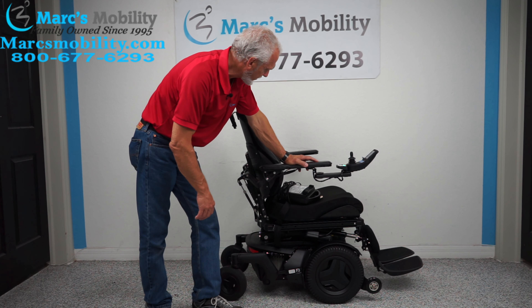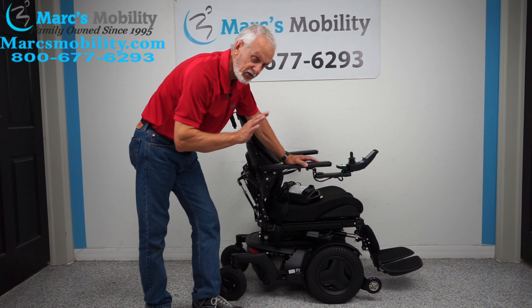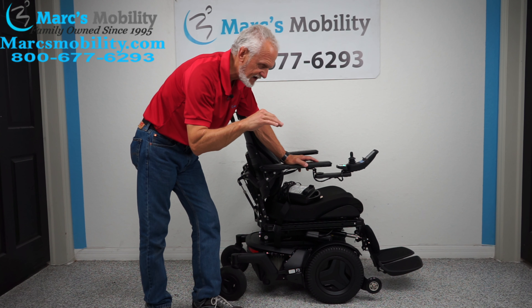This chair has seven miles. It has the electric tilt, the electric recline, and the electric feet. This one only has three functions — no seat lift.